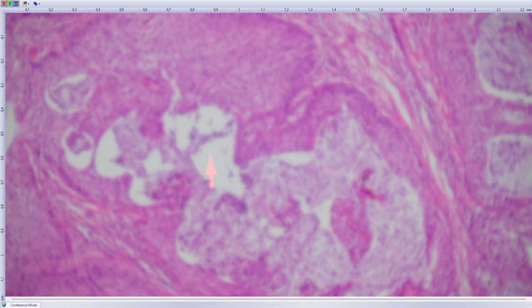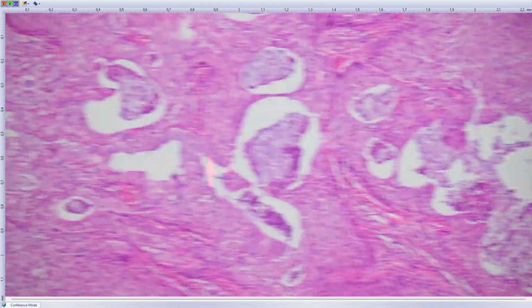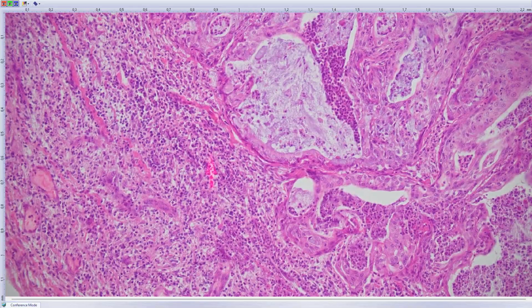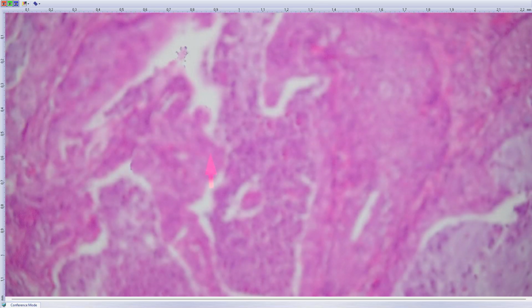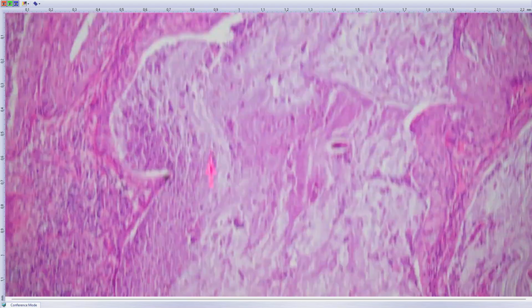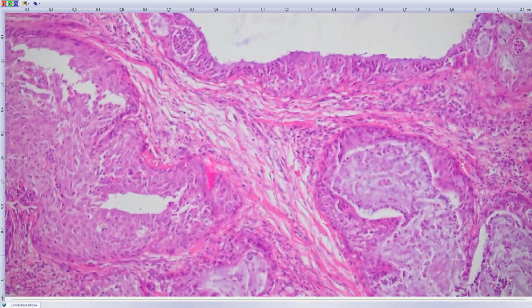I don't know, have you seen anything like that? I have seen the case. You showed me, yeah, but previously, not in the eye. This is conjunctiva, correct? The location is conjunctiva. Yeah, I have not seen. Probably because it's from the exenterated eye. It may come from the lacrimal glands. It can, but it's still the same tumor types in the lacrimal glands.